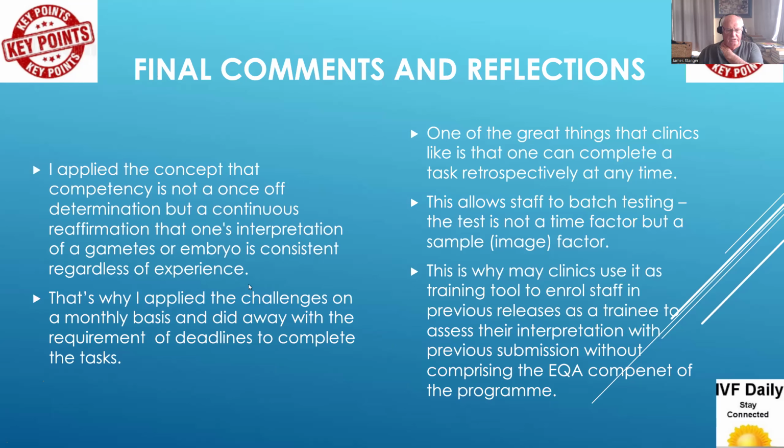That's why I applied the challenges on a monthly basis and did away with requirements for deadlines to complete the tasks. You can, in fact, go back and do all your schemes in your own time. What I'm interested in is not so much the timing of it, but the difference in the different quality embryos or sperm that you're assessing. One of the great things that clinics like is that one can complete the task retrospectively at any time.